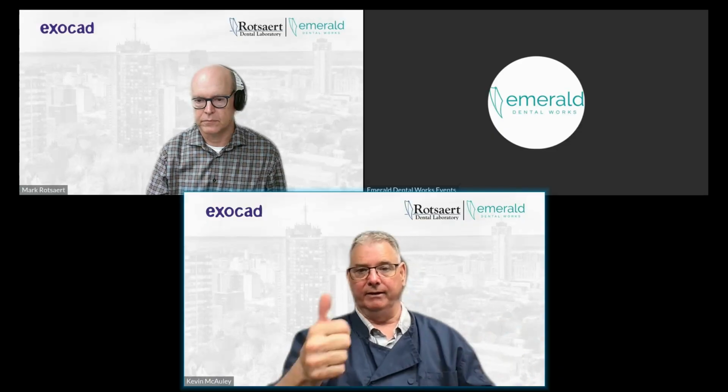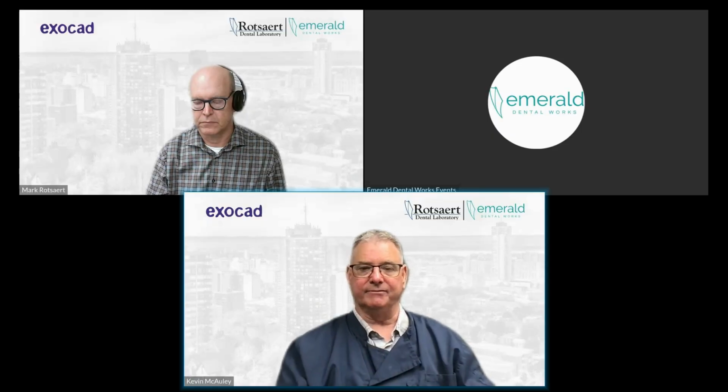And again, that is an email of a PDF so that you have the initial thoughts on what we see we can do. And then, of course, there's a bit of back and forth, and then we can do a live review from there. And then the surgical guides, we ask for 5 days from the thumbs up. We're going to go forward with it to the point where we'll print it out, QC everything, make sure everything's fitting properly, and get it back to you.